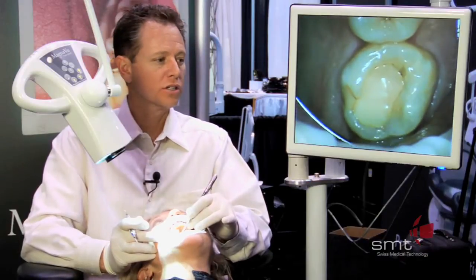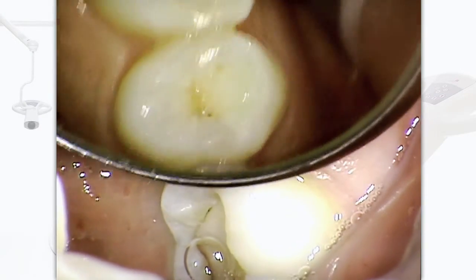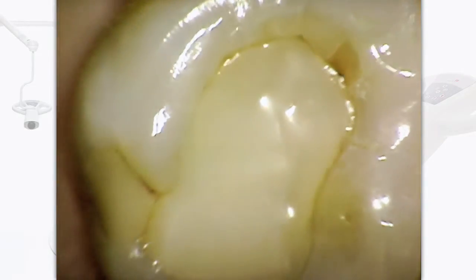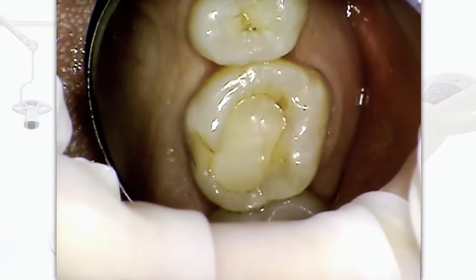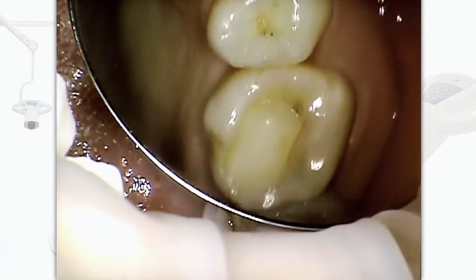Now I'm going to show you how the Dentaloscope 2D looks when we're working on an actual patient. You can see how much more alive the teeth are. You're able to see old fillings. You're able to zoom in and zoom out. You see so much detail that you normally wouldn't be able to see, and we can do the entire quadrant real easily.